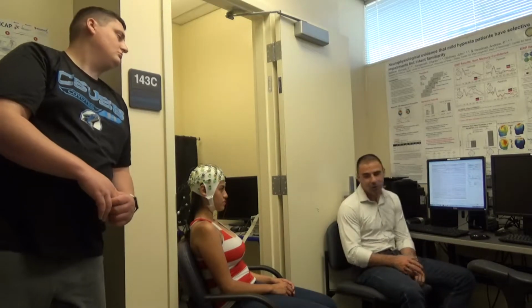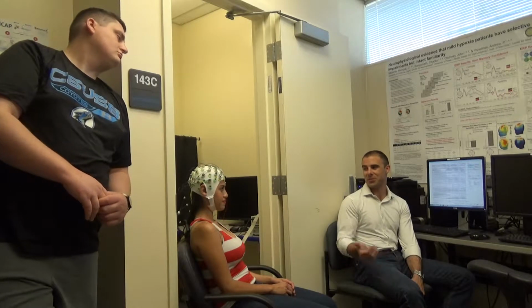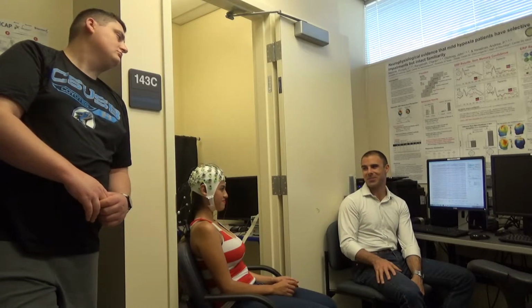Sometimes that's all they need, and they're just like, yeah, it's been kind of a long experiment, I'm kind of tired, a break would be awesome if we can do it. So you're like, yeah, absolutely, no problem, let's do that. They get a little something to eat, refresh, and then they come back for that last round of 50 trials. And they're not fidgeting and moving around and doing all those things. Nayla's being a great participant right now, she's not doing those things for us.